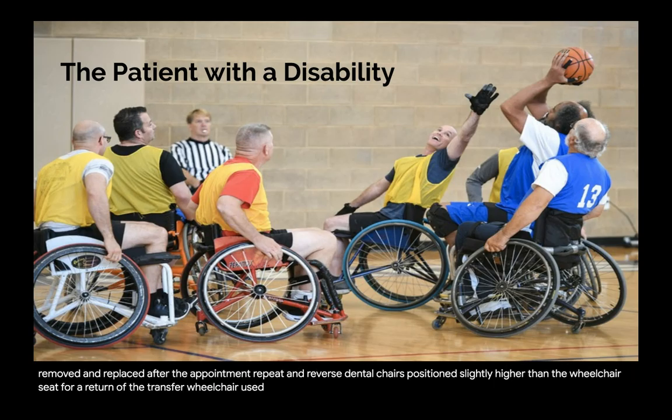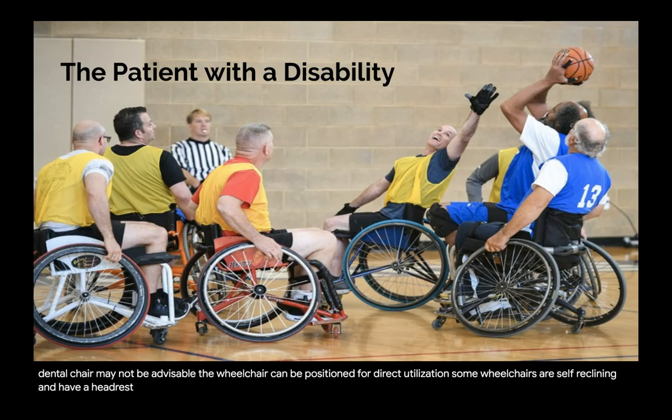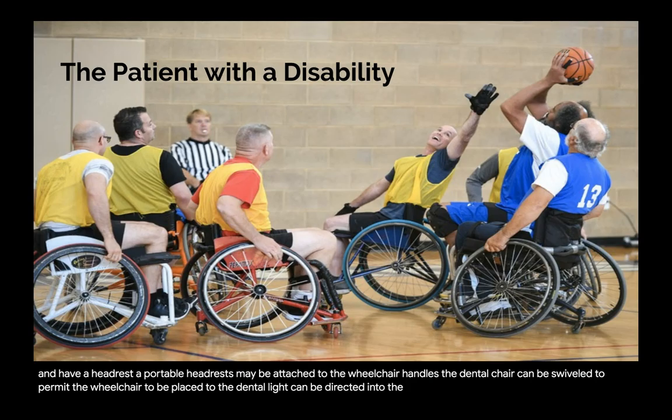Wheelchair used during treatment. When the patient is in total support, wheelchair transfer to the dental chair may not be advisable. The wheelchair can be positioned for direct utilization. Some wheelchairs are self-reclining and have a headrest. A portable headrest may be attached to the wheelchair handles. The dental chair can be swiveled to permit the wheelchair to be placed so the dental light can be directed into the patient's oral cavity.